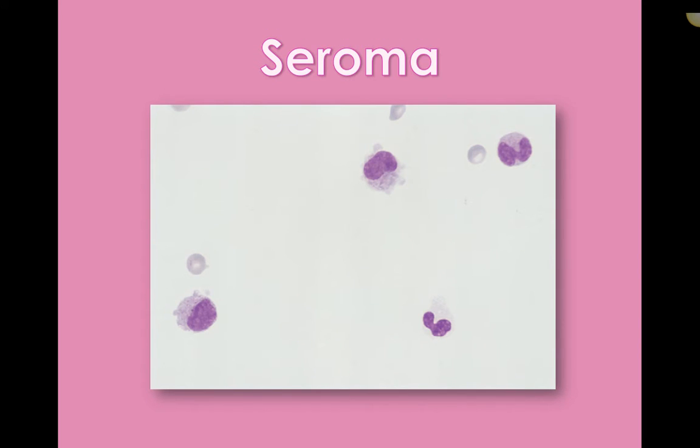So we've got some macrophages kicking around, a couple of red blood cells, a fairly low cellularity sample.